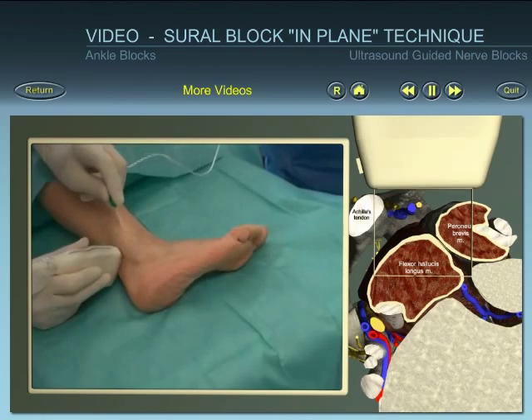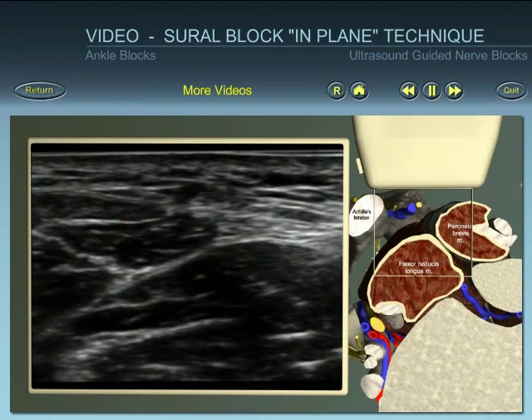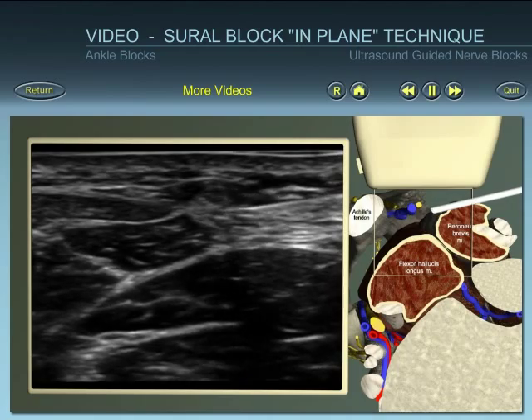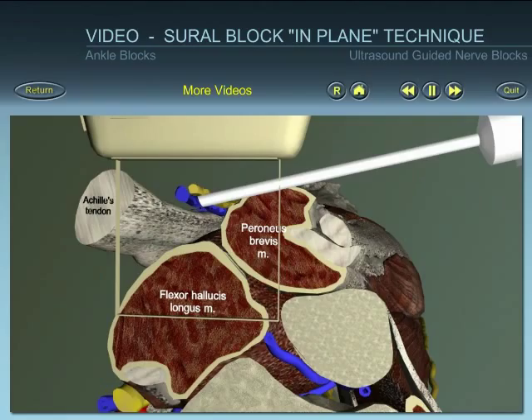Insert the needle at the outer anterior end of the probe. Identify the needle within the ultrasound beam and direct the needle towards the sural nerve. Position the needle close to the nerve, avoiding direct contact with the nerve.